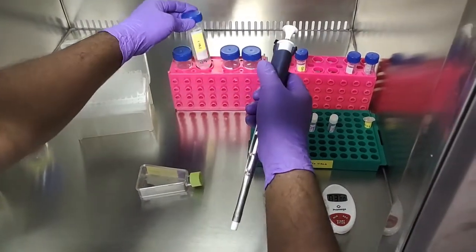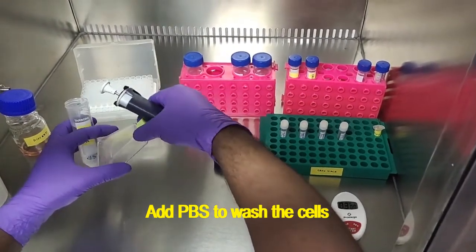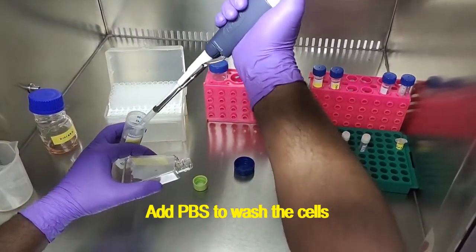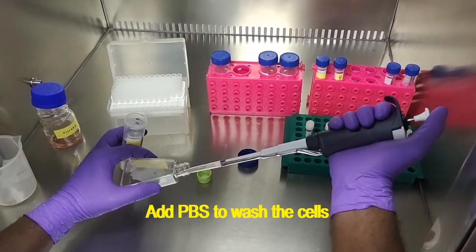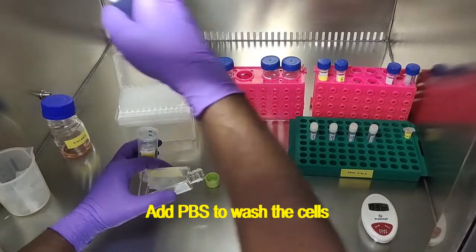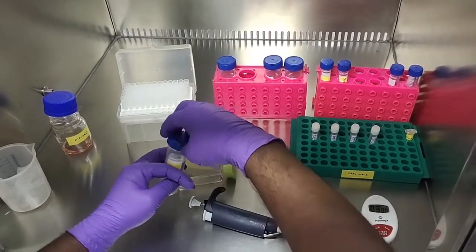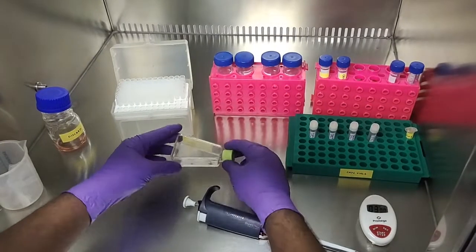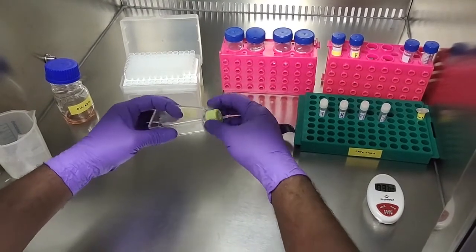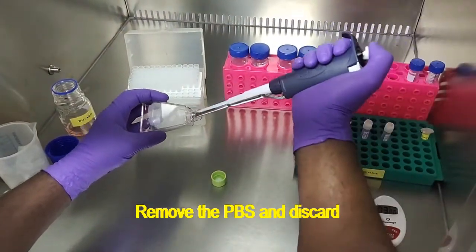The next step is to add PBS to wash the cells. You can gently tilt the flask. Then we use the micropipette to remove the PBS and discard it.